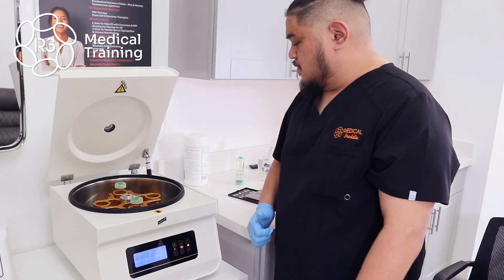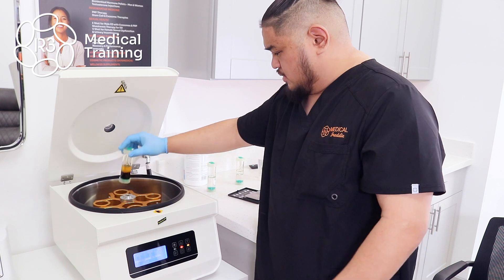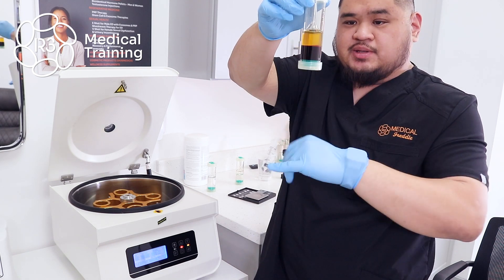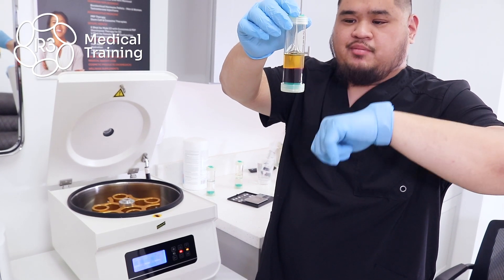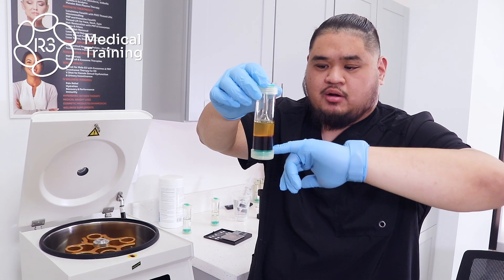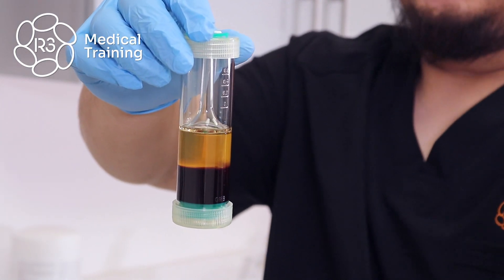Once the centrifuge opens and the spin cycle stops, you can go ahead and pull out the counterbalance, put it aside, and take a look at the tube with the blood specimen that we just spun down to check for separation. As you can see, there are three distinct layers: you have the red blood cells at the bottom, in the middle you can see the cloudy milky mass which is what we call our buffy layer, and everything above that up to the top layer is your plasma layer.